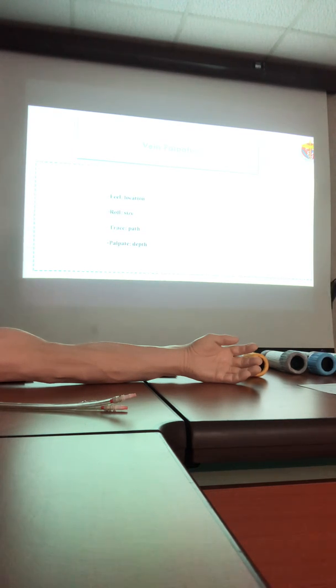One of them, wrong order of draw, can cause a high elevated level of potassium. We have a correct order of draw, and we should follow this order. If there is something wrong, the result will be affected, and sometimes the potassium level will become high.